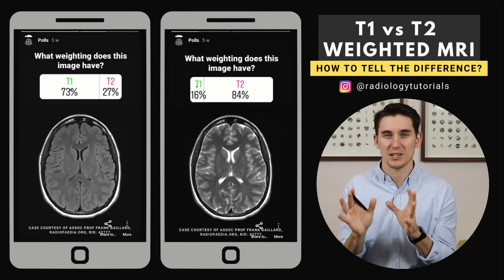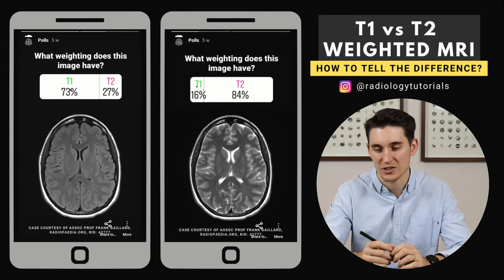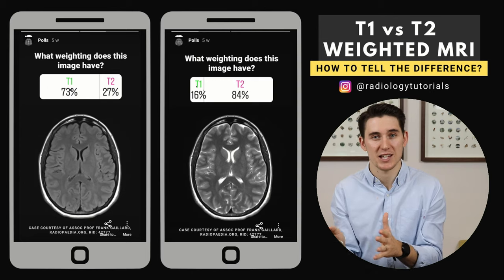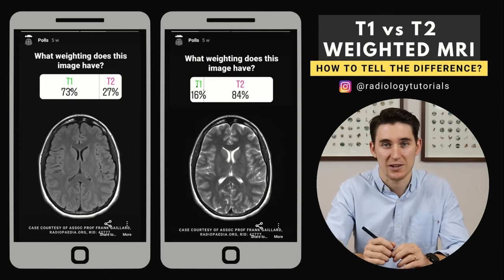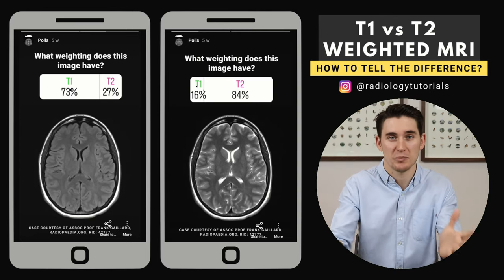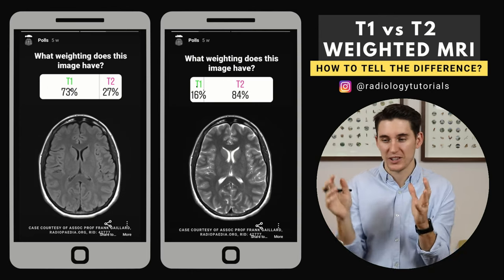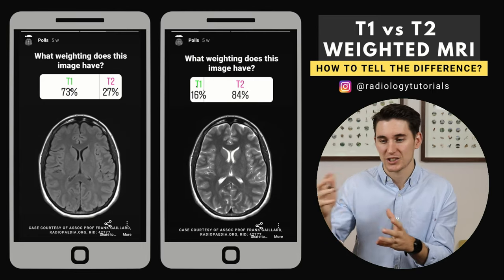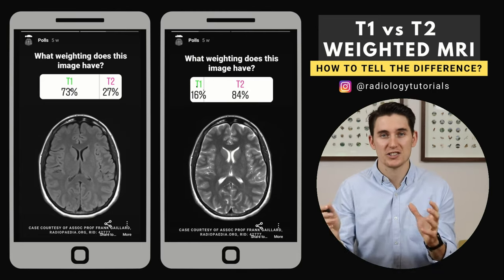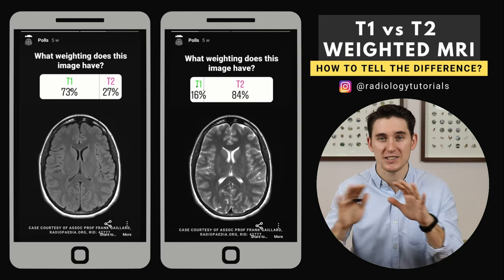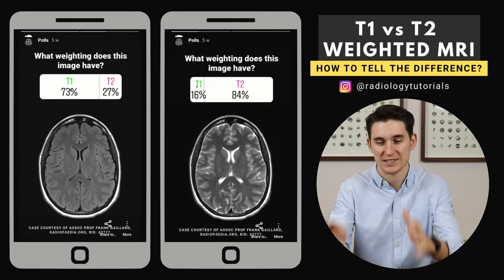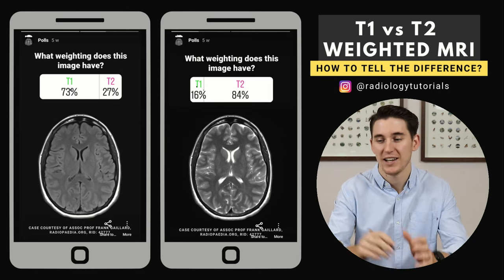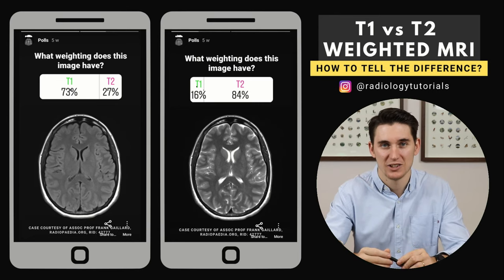In fact, both of these images are T2 weighted images, and I did it on purpose because my suspicion is that most people would have looked at the CSF. It's what you're taught in med school. They don't really go into the depths of the physics around MRI because it's such a complex topic. So they just give you a general rule for purely T1 or T2 weighted images: look at the CSF — if it's dark it's T1, and if it's bright it's T2.